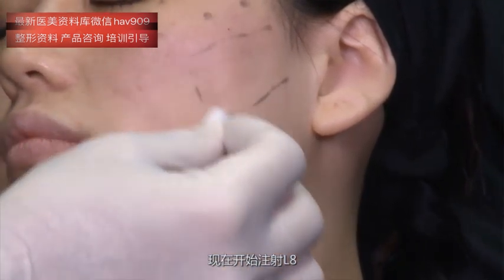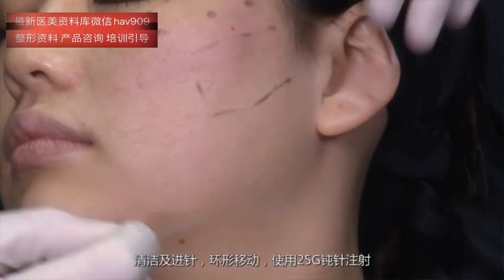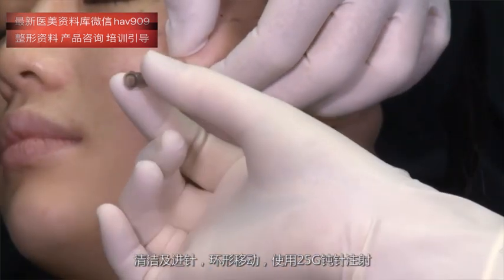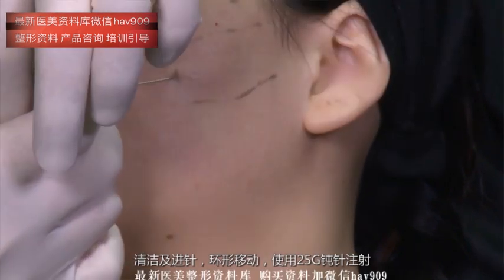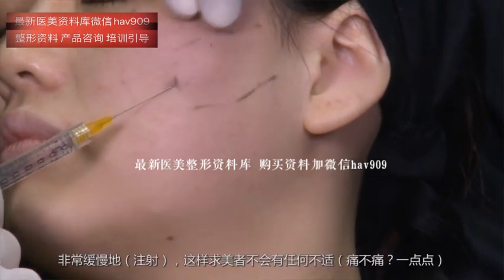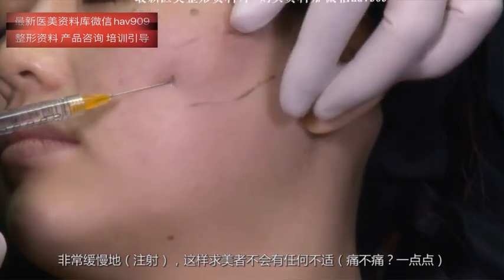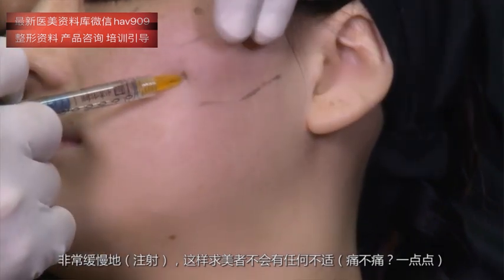Now let's proceed with L8, cleaning, entering the point, circle movement, and injecting with a 25 gauge cannula. Very slowly, so that the patient does not suffer any discomfort.